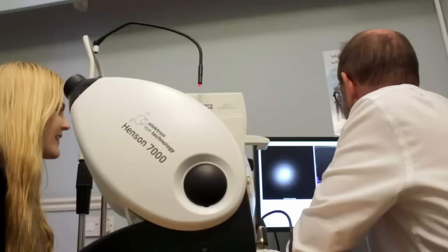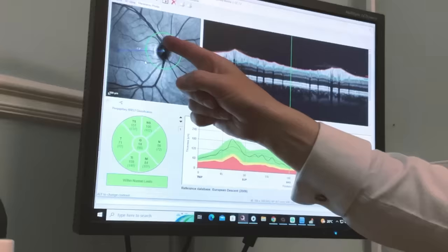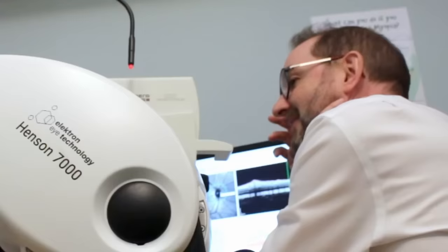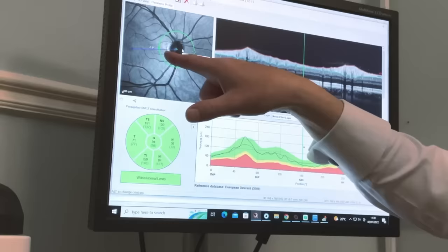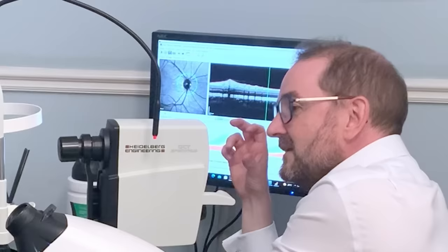I'll show you the images here as well. So this is your optic nerve here, where the vessels go out the back of your eye. It's really sharp, actually. It's a good image. Basically, with glaucoma, you have an increased pressure in the middle of your eye, and that causes damage to the optic nerve at the back of your eye. It affects the thickness of the nerve fibre layer on your optic nerve, and if that gets thinner, then you get a loss of visual field. You start losing areas of your vision. So that's sort of what glaucoma is.